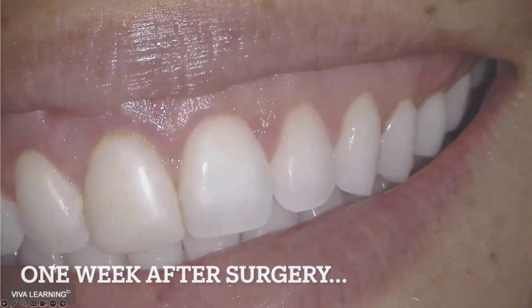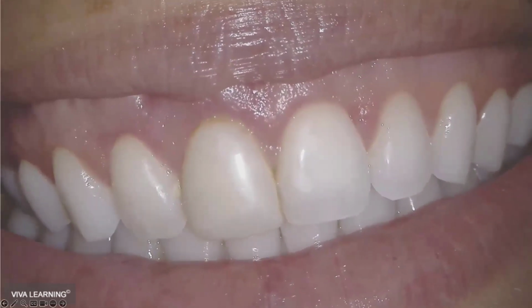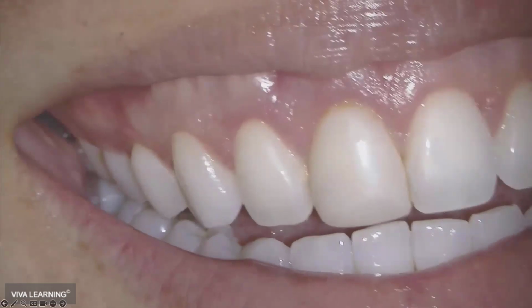And here's 1 week after surgery. All right, 1 week. So was she numb? We used a little topical. That's it. Right. And then filled that gap in with a little composite. And then here's how she actually heals up from that. So this is why we're so excited for this.